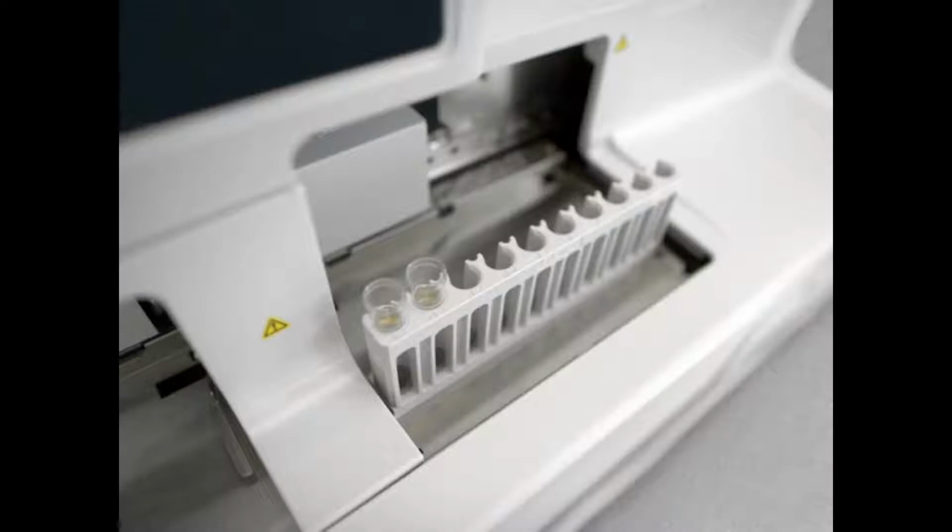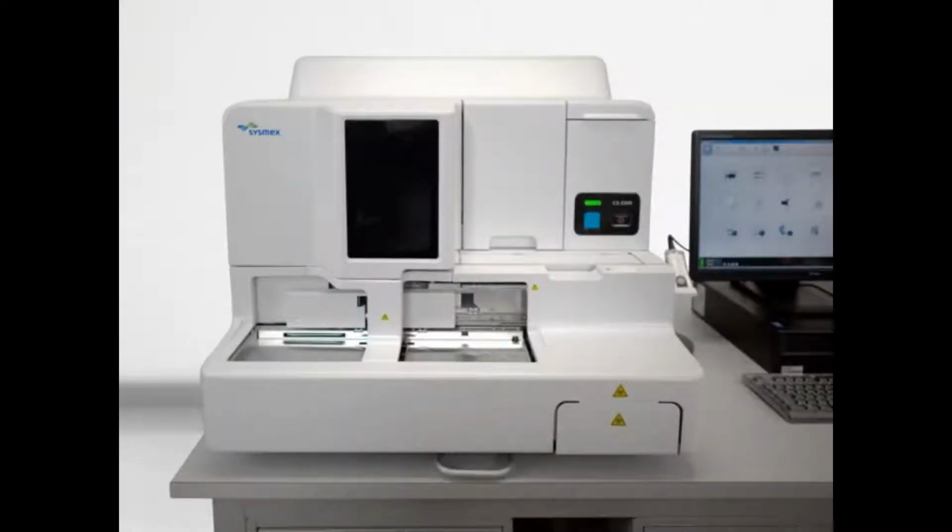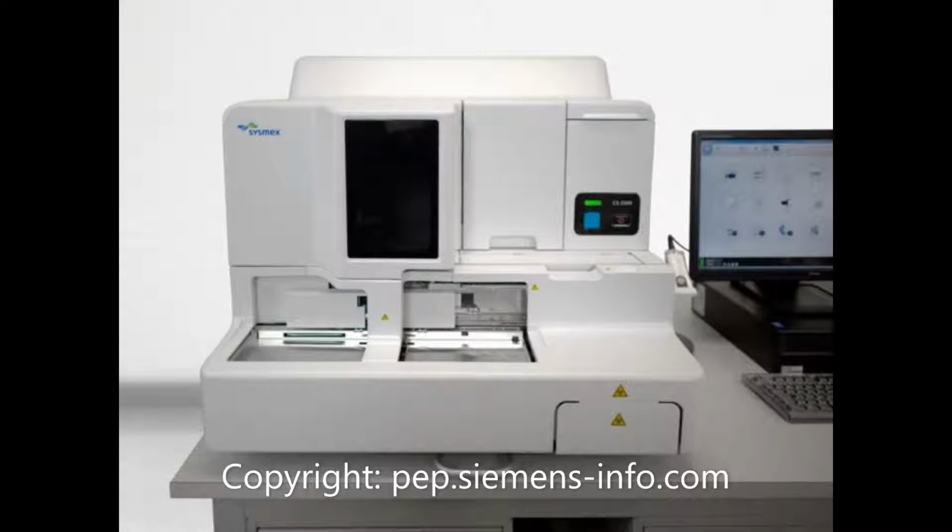The rack being used has a label on the side which says cups. The other racks say 2.7 mLs, and those are for regular specimen tubes. Do not use those. Use only one of the 2 racks that says cups on the side.